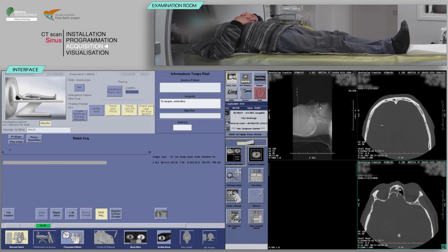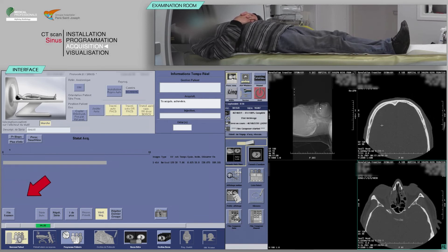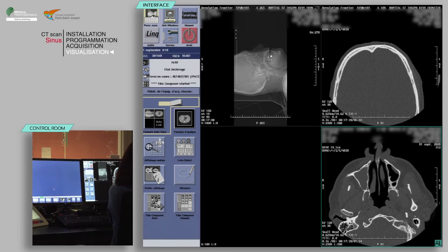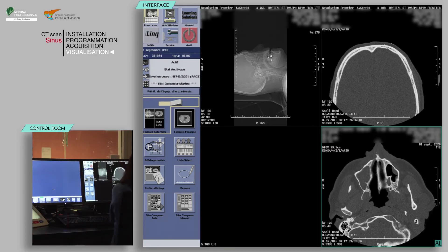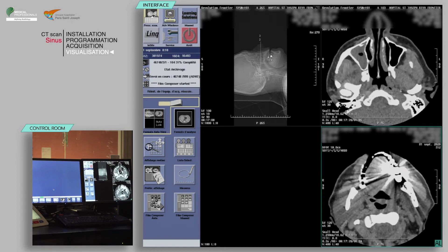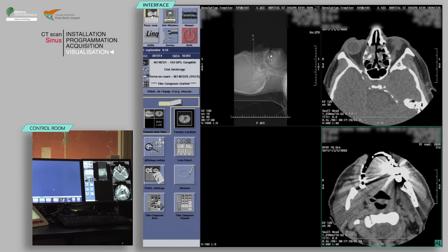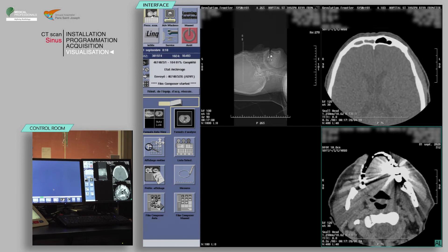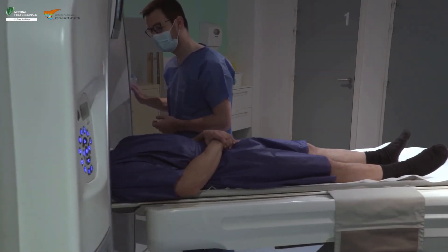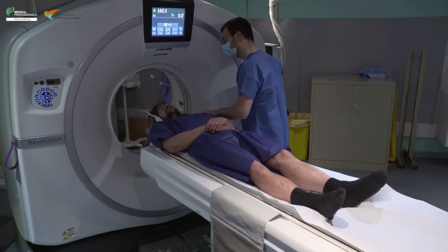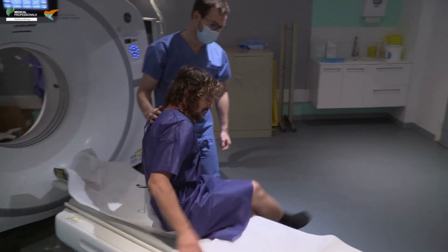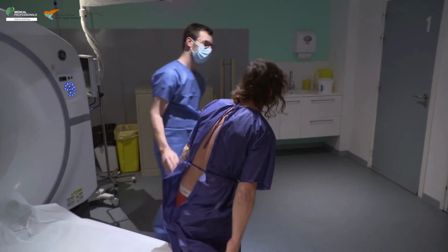Verify the absence of patient motion on the acquisition. Click on End Exam. Provide the patient with any post-examination instructions as indicated at your facility. At the end of the examination, accompany the patient back to the changing room and tell them they can get dressed.